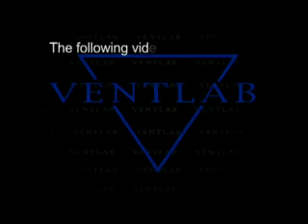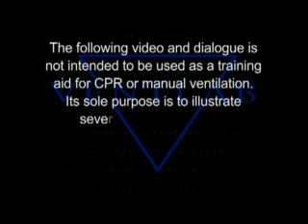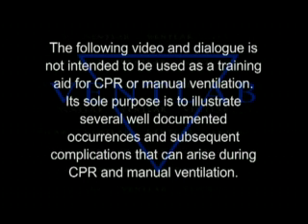The following video and dialogue is not intended to be used as a training aid for CPR or manual ventilation. Its sole purpose is to illustrate several well-documented occurrences and subsequent complications that can arise during CPR and manual ventilation.